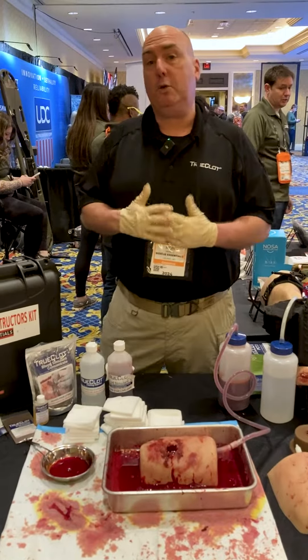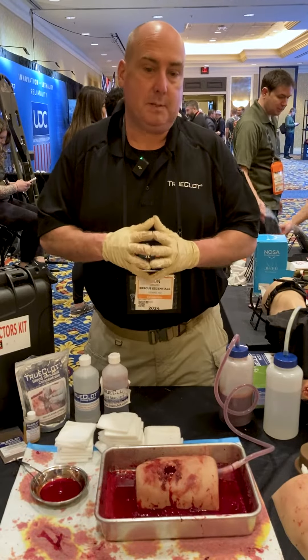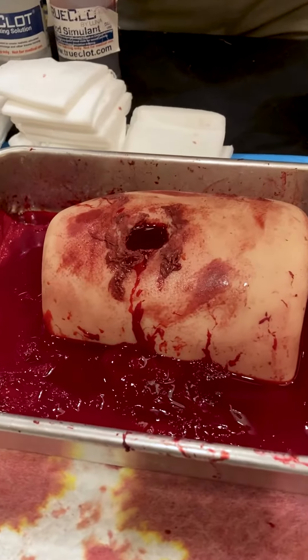Hey everybody, Ron Wensler from TrueClot. We are here to do a demonstration on some of our TrueClot products. We're going to simulate packing a wound here. With our TASH trainer, it feels like flesh and we have the simulated blood that replicates real blood.